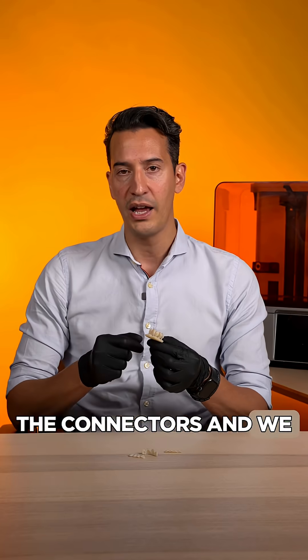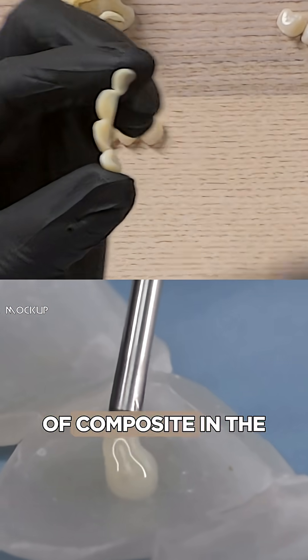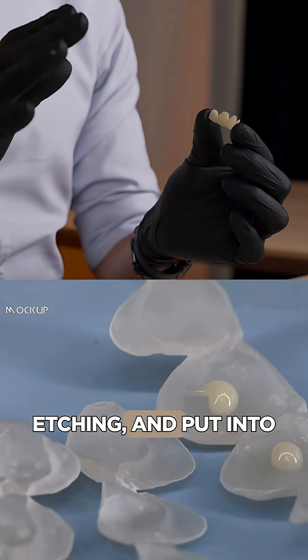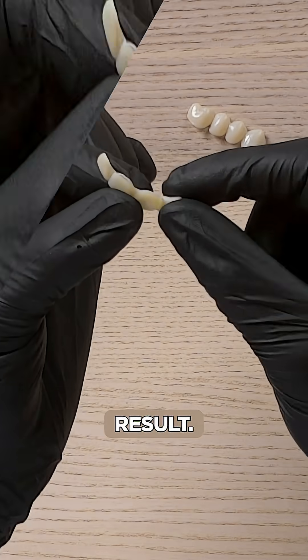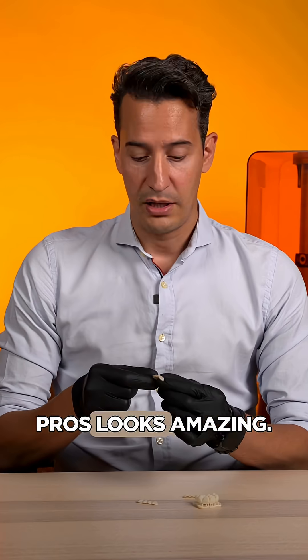This is the outcome — just take it out from the printer, cut the connectors, and we are ready to place it into the patient's mouth. Just put a small drop of composite in the internal area of the shell — no bonding, no etching — and put it into the patient's mouth, some light cure, and voila, you have a beautiful result.